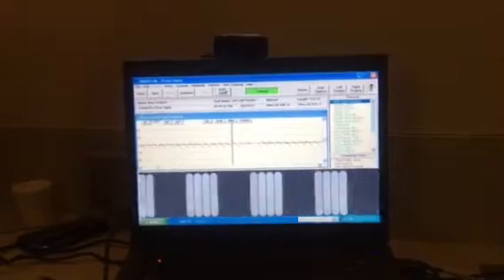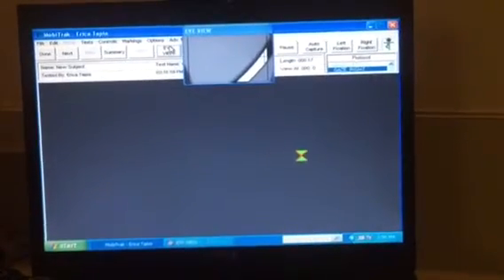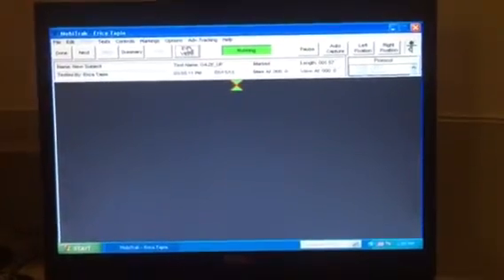Okay. So, then it goes in this direction. Then we have the gazing tests. The gazing tests are just preset timers where your patient gazes to the left, gazes to the right, gazes up, and gazes down. Very good.